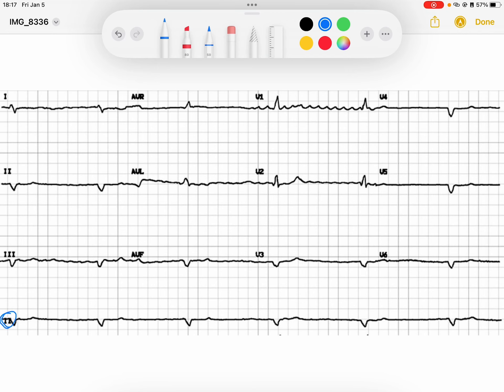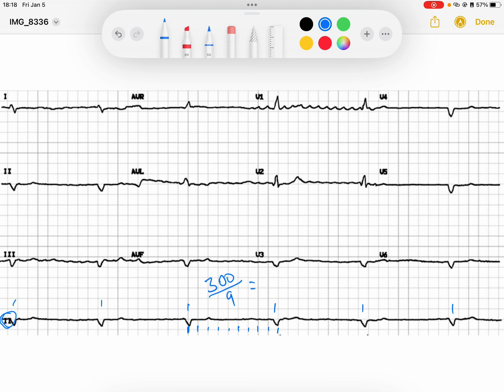I'm going to start off by taking a look at the forest, and the trees of the forest are my QRS complexes. Coming down here to lead 2, I notice I've got a wide complex, regular but very slow rhythm. If I start here, I see this rhythm kind of ends on the solid line. Checking my rate, I've got one, two, three, four, five, six, seven, eight, nine big boxes. So I can calculate my rate to be 300 divided by nine — that equals something a little bit greater than 30, so maybe 31 beats per minute. So we have a bradycardia, and I've got a wide complex bradycardia here.